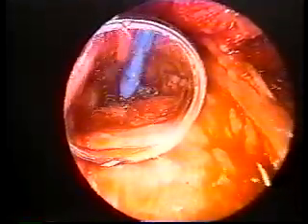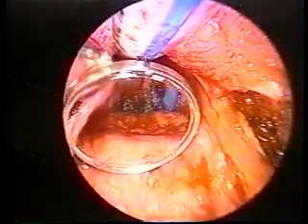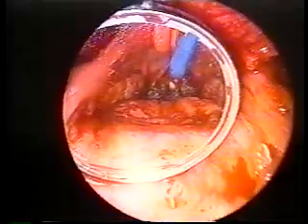In a prospective, non-randomized trial conducted at Ochsner, we found that a partial adenoidectomy performed with a microresector was superior to the procedure performed with curettes. The average total operative time for a partial adenoidectomy performed with a microresector in over 100 patients was 3 minutes 21 seconds. The actual tissue removal was usually completed in under 1 minute, and the majority of time was spent achieving hemostasis. The average operative time for the procedure using curettes was just over 8 minutes.